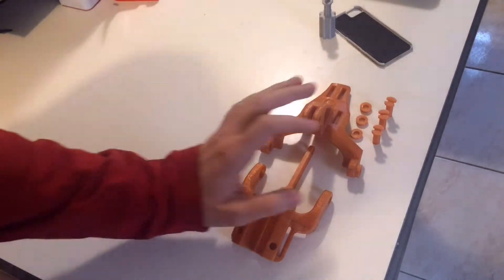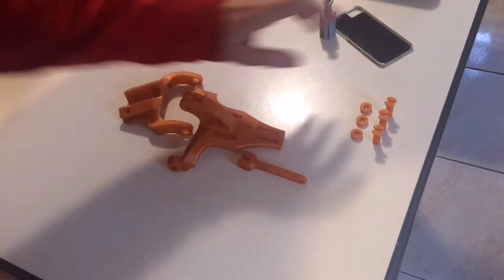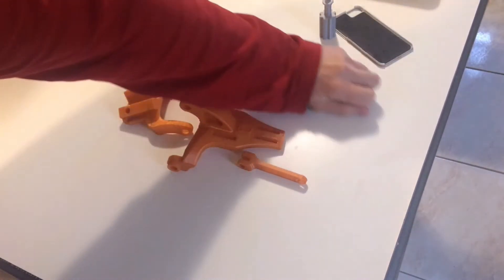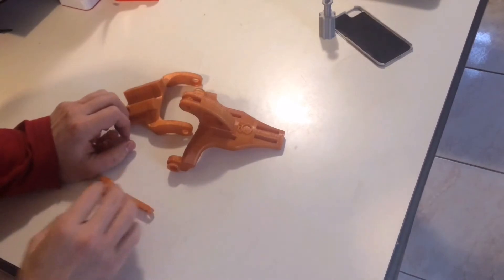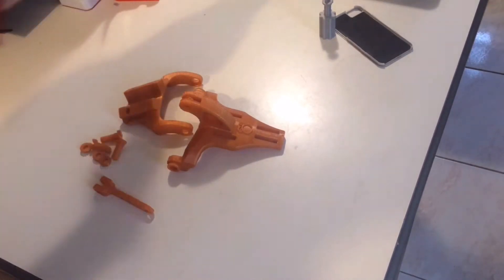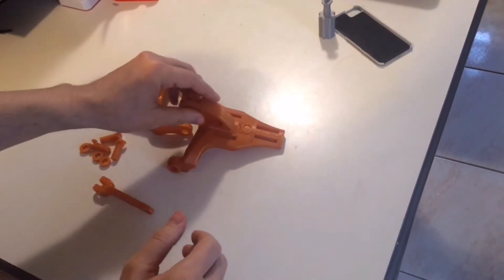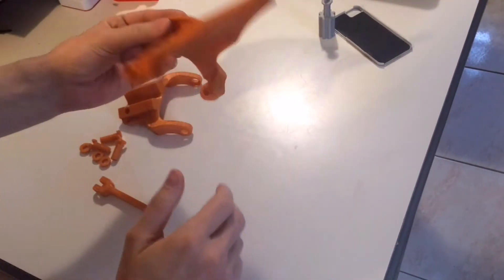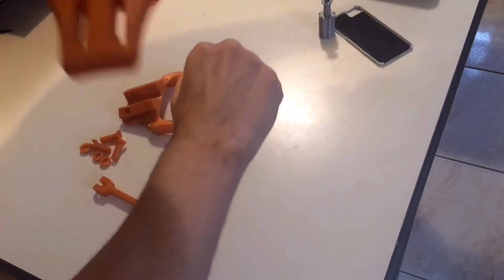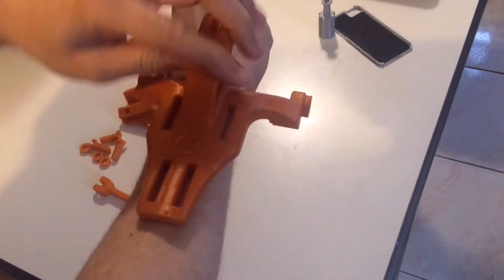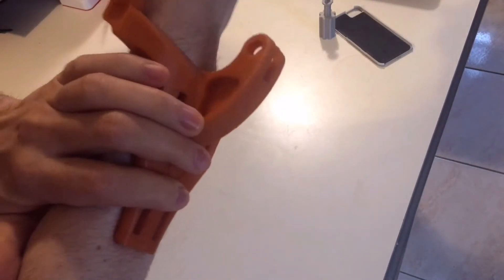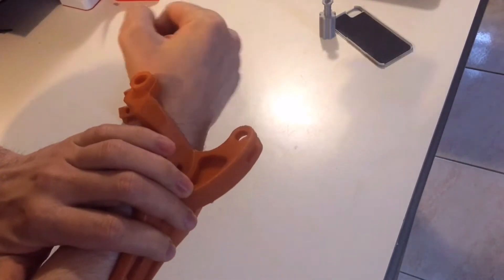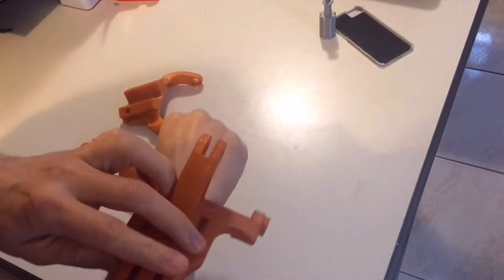Alright, assembly. Very simple. This piece will go here on your arm. Alright, you see that? I'll put it together real fast.